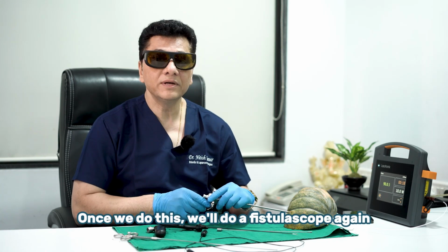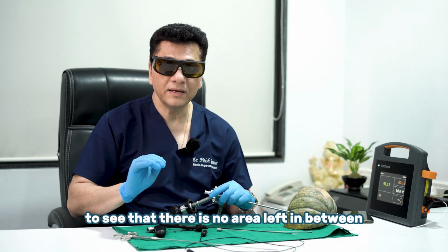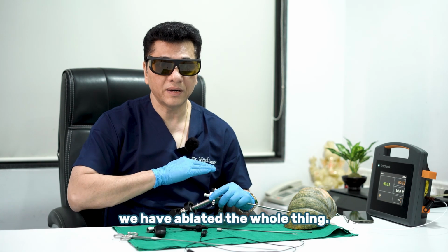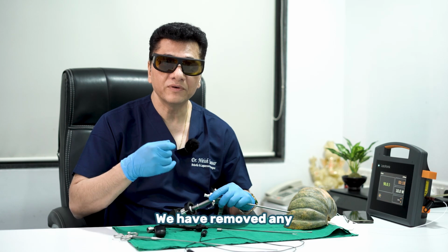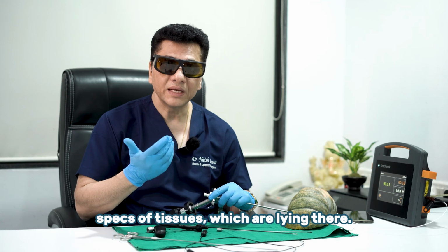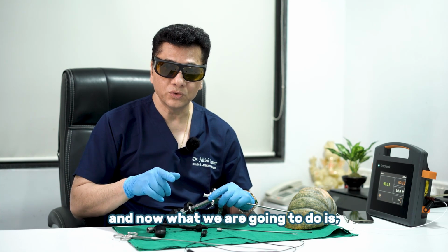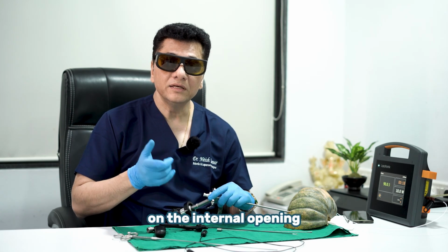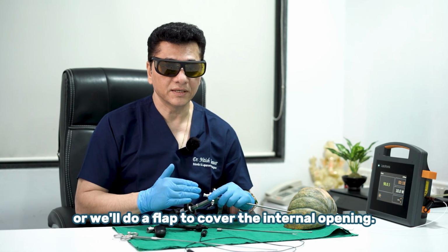Once we do this, we will do a fistuloscopy again to see that there is no area left in between. From the outer opening to the internal opening, we have ablated the whole thing, we have burnt the tissue, we have cleaned it using a brush, we have removed any specks of tissues which are lying there, and then we flush the tract completely. And now what we are going to do is the stitches which we have left behind on the internal opening, either we will close it or we'll do a flap to cover the internal opening.